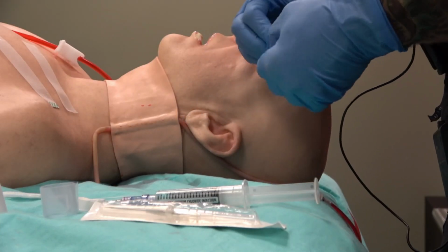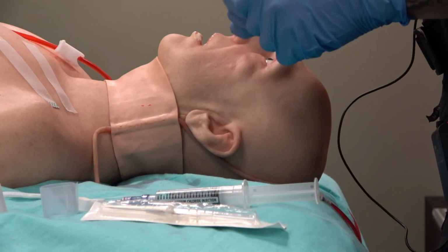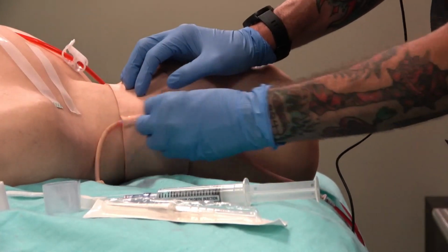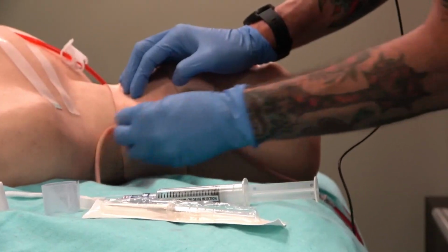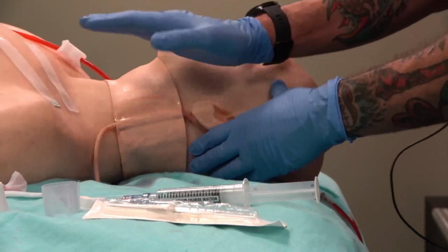I'm going to tear this open. There you go. All right, I'm going to turn the patient's head to the side here, and I'm going to wipe the area clean. Okay. Let me open this trainer up so I can actually use it.